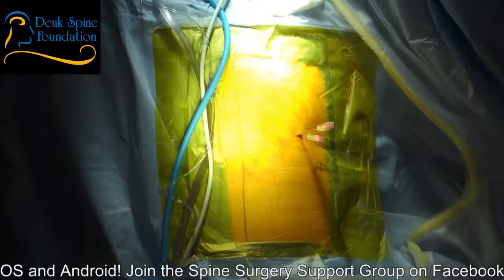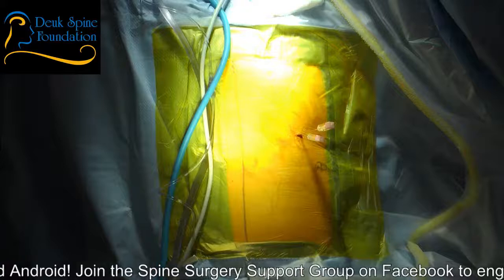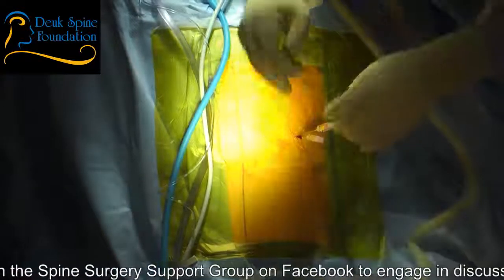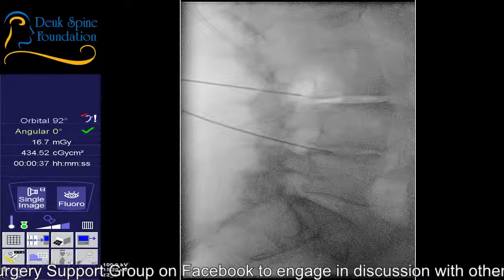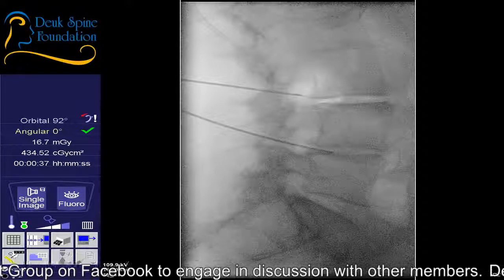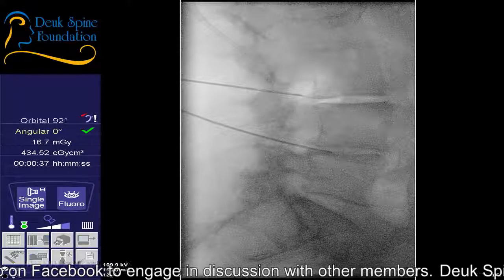That's better. So you can see now I'm actually hitting a bone spur off the superior end plate. So I'm dancing around the foramen, and I am getting closer to our goal, but not quite there.